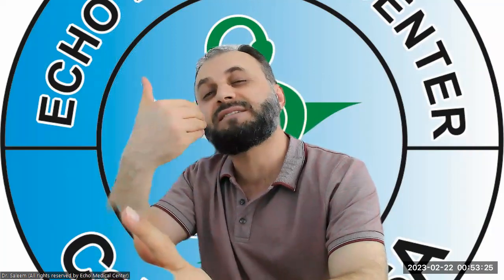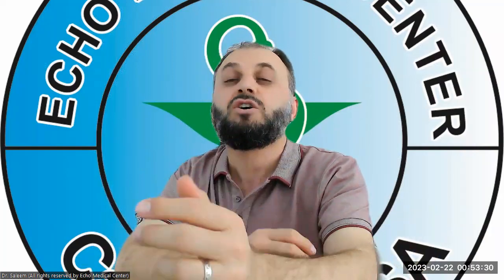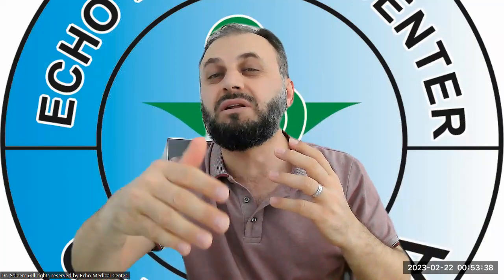Okay, and then after that, we come to the sagittal or longitudinal images. We start again from the proximal CCA, and try your best to see that curve. If it's a right CCA, see the innominate, the brachiocephalic artery, if you can. If it's the left CCA, try your best to see the arch area, if possible. Go as far down toward the clavicular bone as you can to see the real proximal portion.